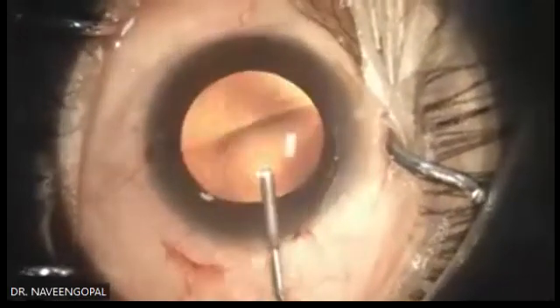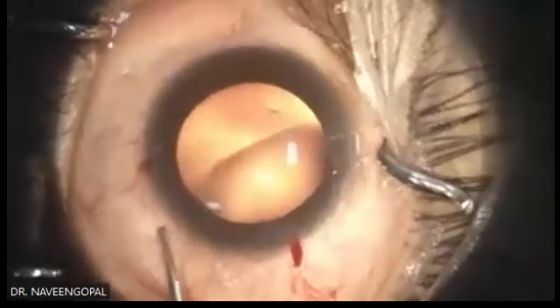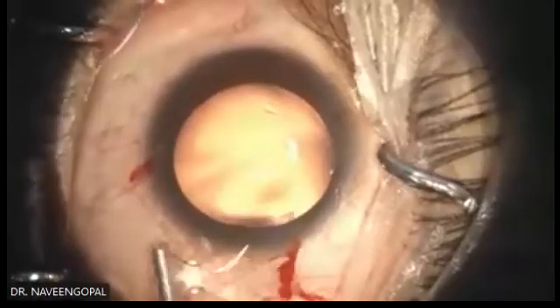Don't overfill the AC. Fill it adequately. That should be enough. It should be soft, but not tight. Just press and see. Yeah, this should be enough.